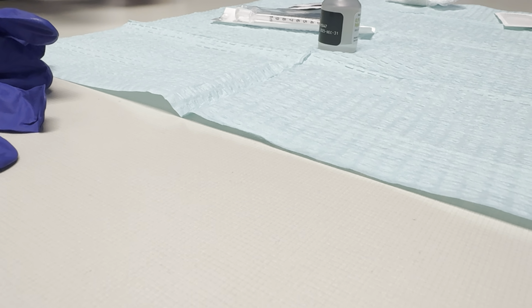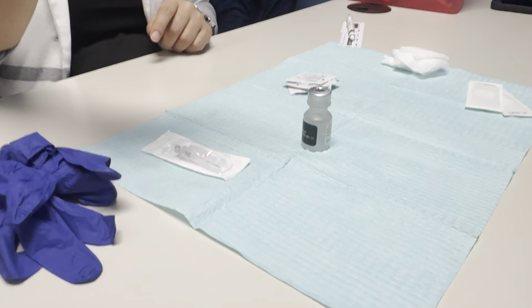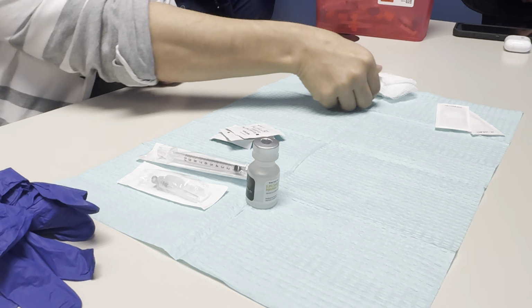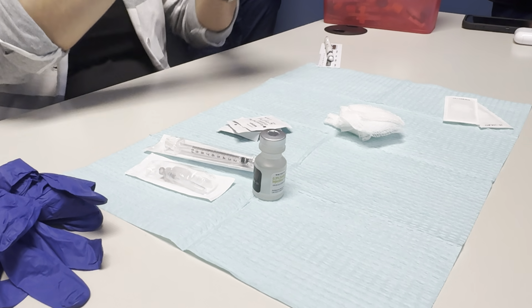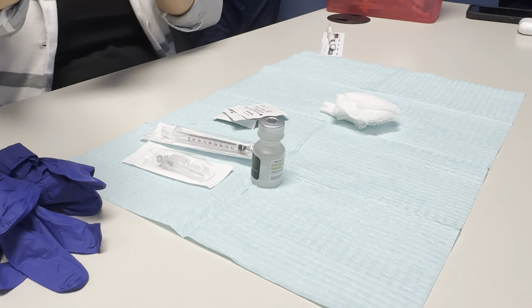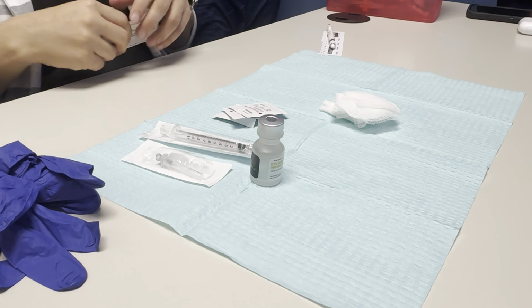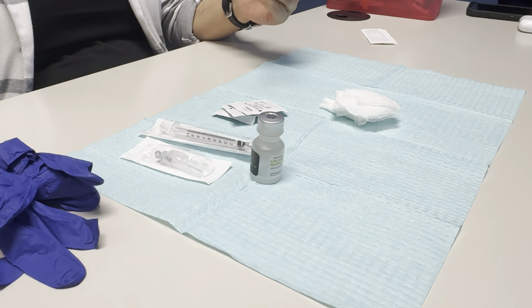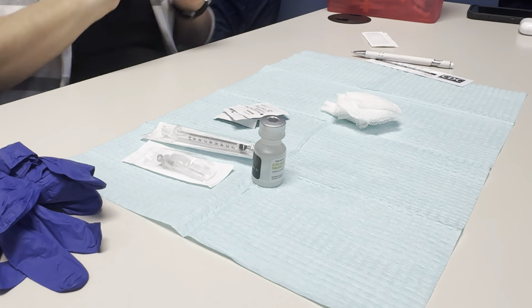Remember, half inch and 25 gauge. I know the 1 cc syringe. I have my vial. I have some alcohol wipes. I have some gauze in case the patient needs to dab it. And then you never ever need bandages for intradermal, but since we're in the class, I always have it. And then I have my ruler for reading, and I have a pen for marking.